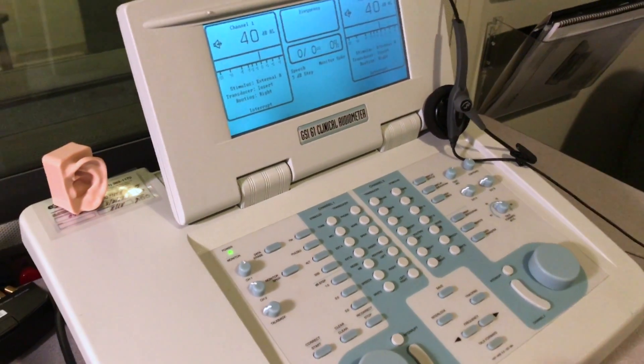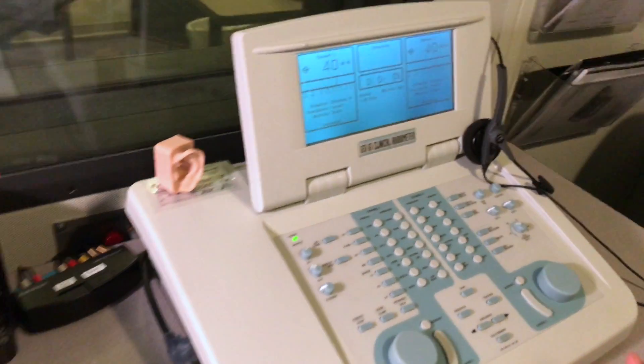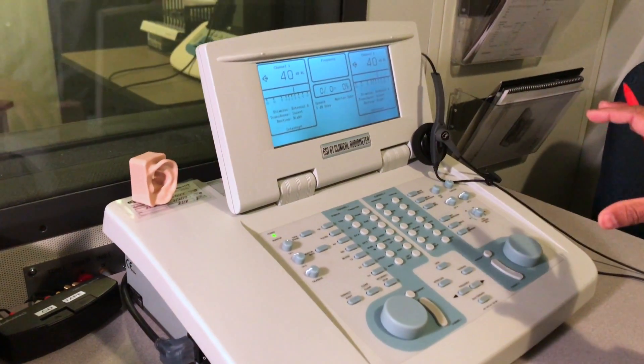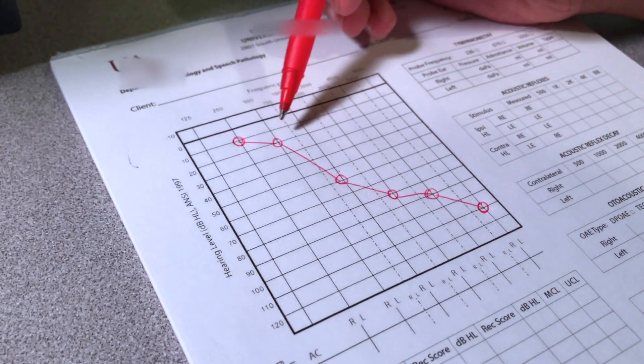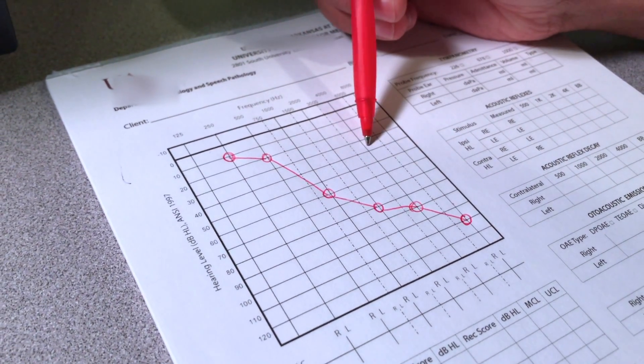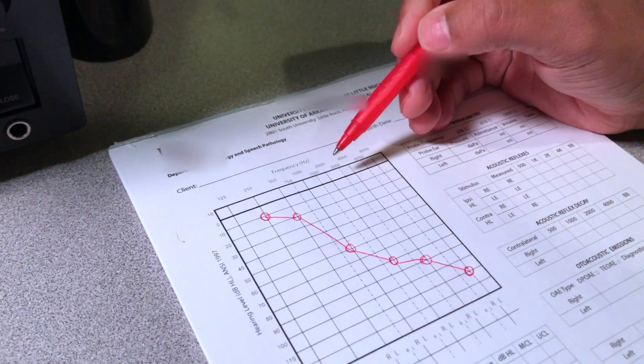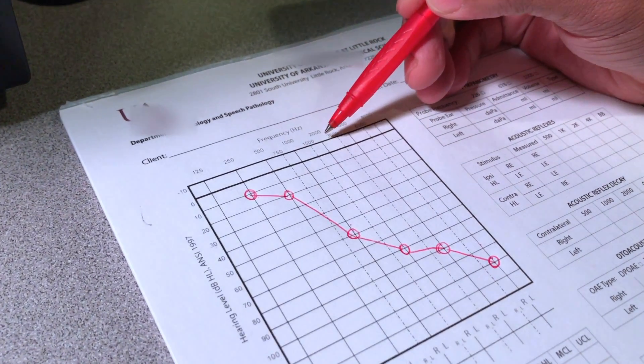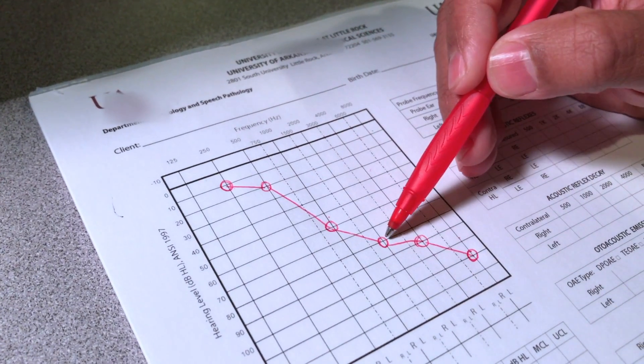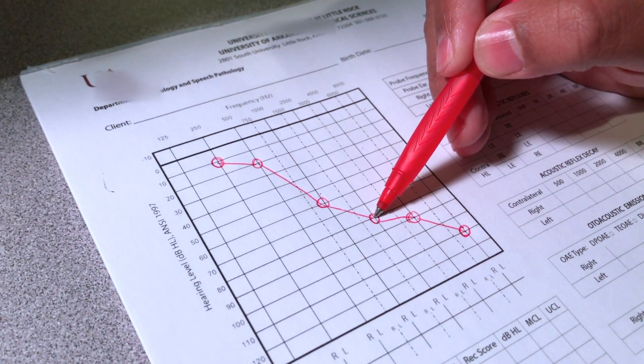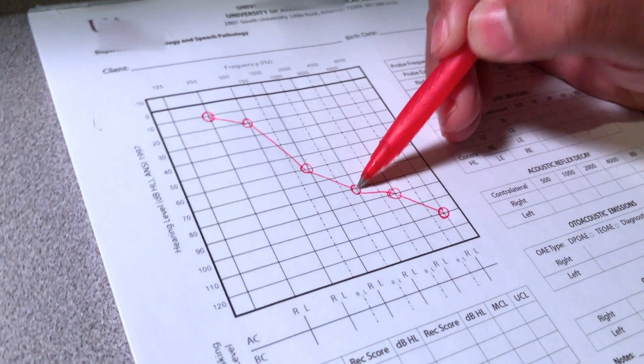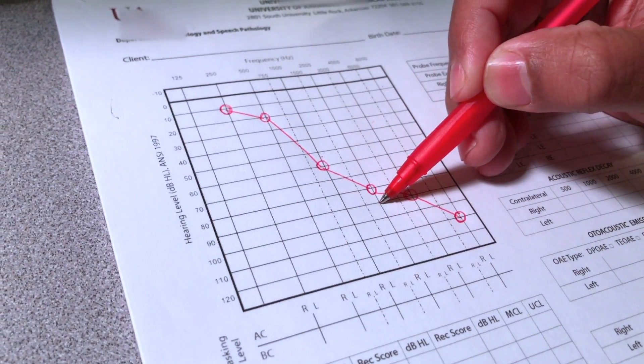Now that we have set the VU meter to zero, what we need to do is set the noise level based on the person's threshold. This test can be performed between 500 and 4000 Hertz. Let's say we are starting to measure the threshold at 2000 Hertz. We're suspecting there is a dead region at 2000 Hertz. What we need to do now is present the noise 10 dB above the threshold.